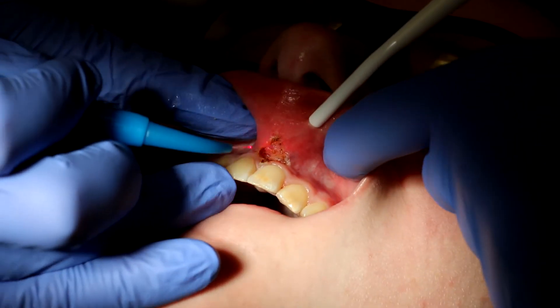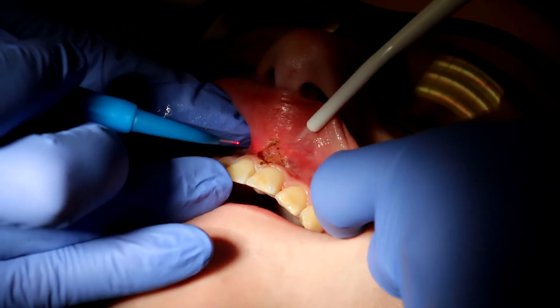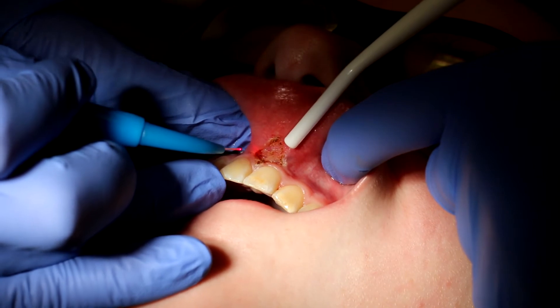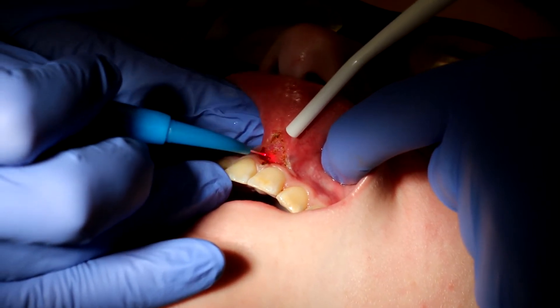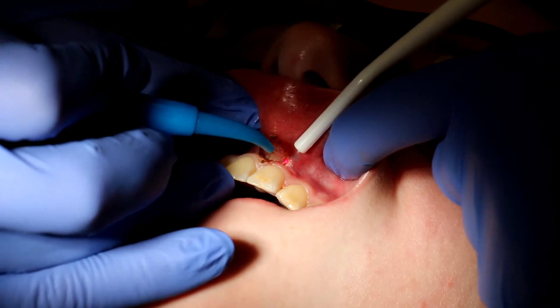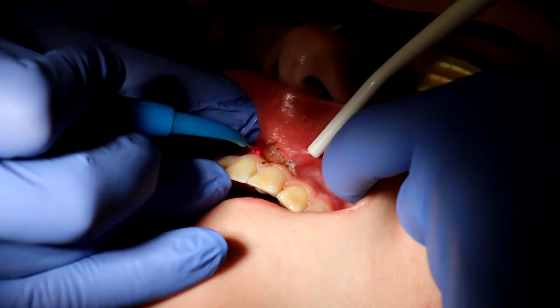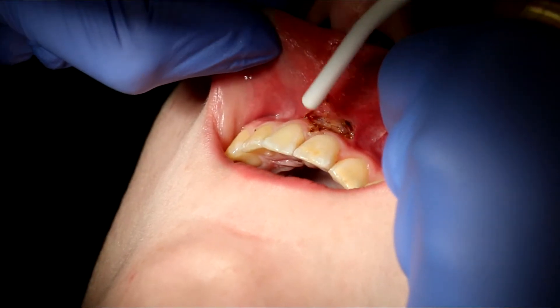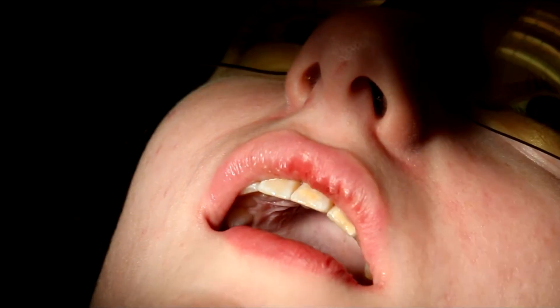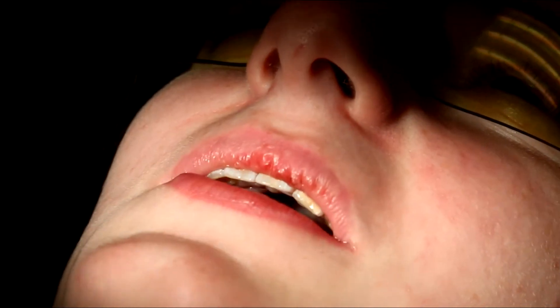This soft tissue here is a bit bulbous from the local anesthetic — we always know how to work around that. We're more than halfway done here. You thought you felt something? No, you didn't feel anything? No. Okay. Did you smell something? No. Okay. All right. That's the worst part of it — the smell?